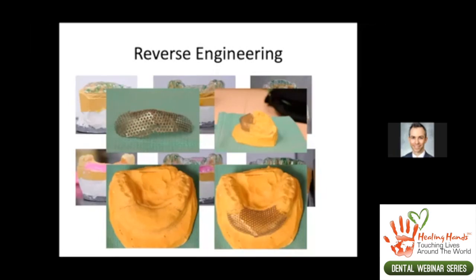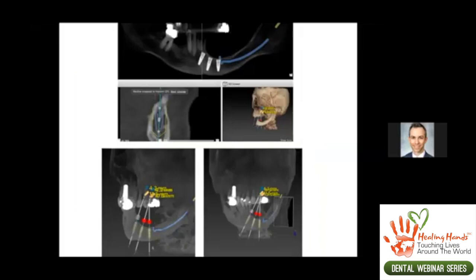Sometimes the bone and the implants will not be in the ideal position, or it might be further palatal in a situation like that. And then we have to think about how we're practically going to get the teeth there. So maybe some kind of a fixed hybrid prosthesis or something else, but it may not be a crown-to-tooth, 1-to-1 type ratio.